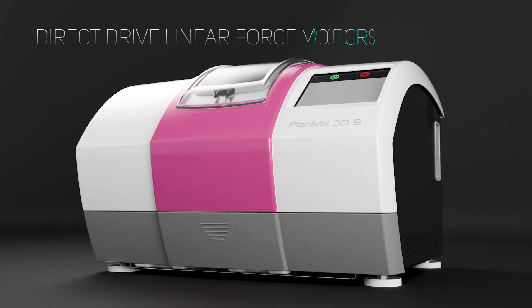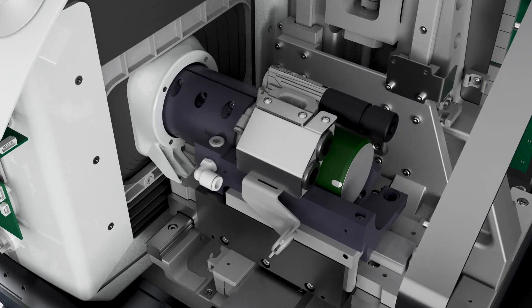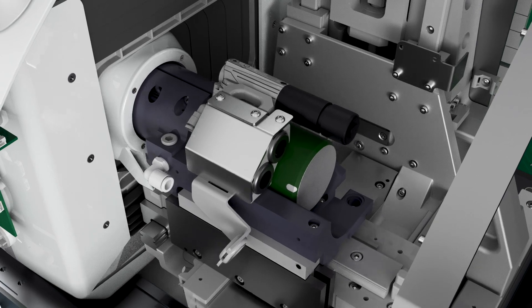Direct drive linear force motors used in the development of aerospace components are unique to Planmeca milling units, resulting in absolute precision of quality restorations.